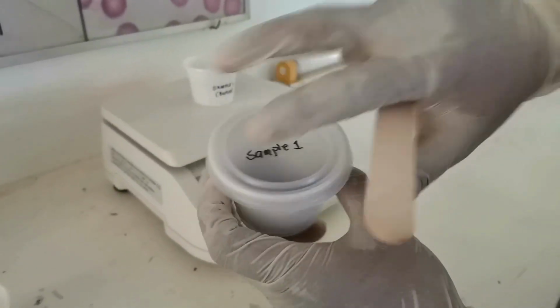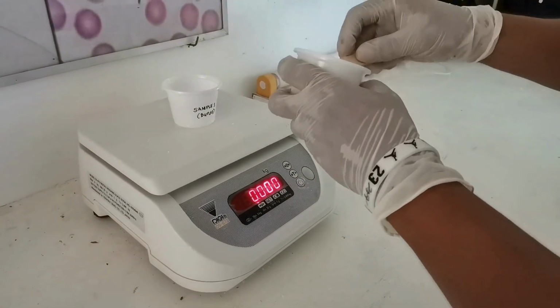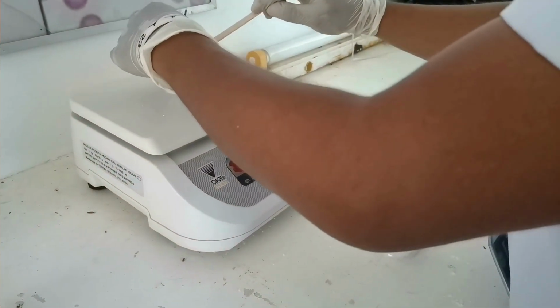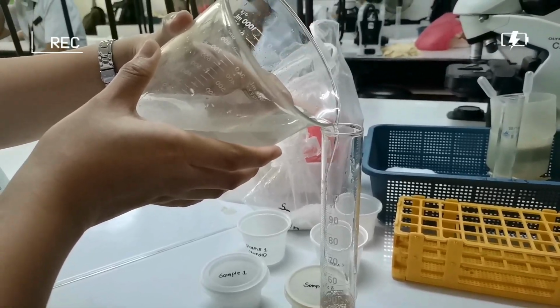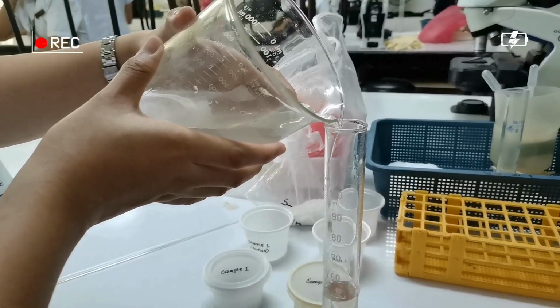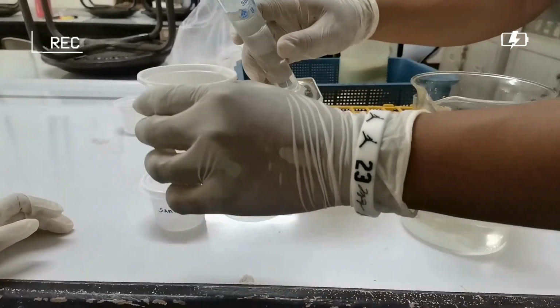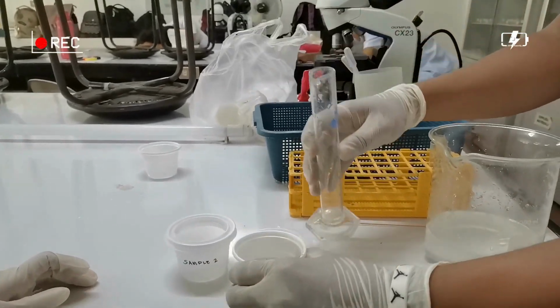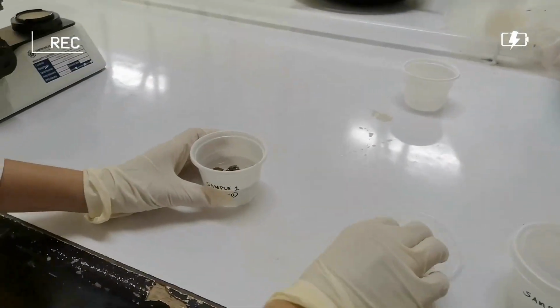Methods in performing simple test tube flotation. 3 grams of feces were measured on the weighing scale placed in a plastic cup. 2.5 ml of tap water was added to soften the feces with the aid of a tongue depressor. 47.5 ml of saturated saline solution was added and mixed until the feces is well dispersed.